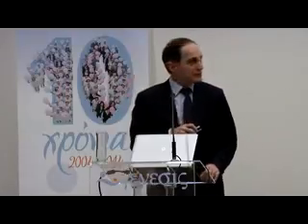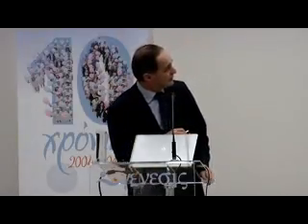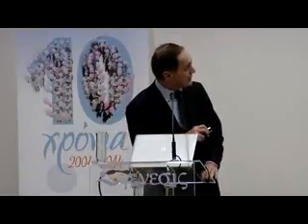And the difference between the black and the gray, you cannot see in ultrasound, or not like here. It's a difference because the function of the cells is different. Both are muscles, but the function is different, and what is interesting for fertility and abnormal uterine bleeding is this area. Now, this area, exploring by laparoscopy would be very stupid, because the way of access is here.